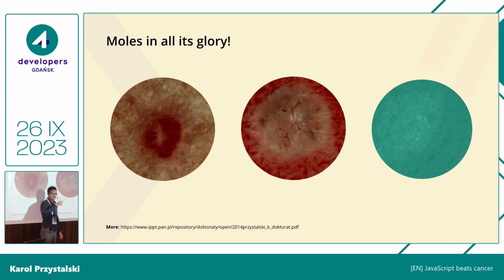Do you remember this blue-gray area? That's here, but now you see it with a different wavelength of light. And here you have these dots, right? Small dots that are very hard to see, but this is also another pattern for skin cancer, specifically for melanoma, because these are dark dots. For example, on the first layer, it might be totally dark, but if you look at it using this wavelength of light, you will see this kind of dot. It means it's going deeper into the skin.